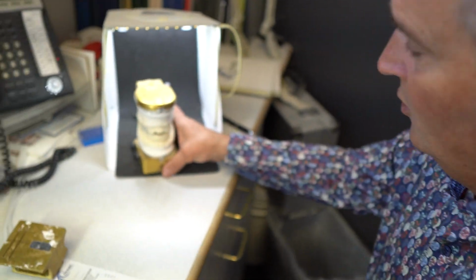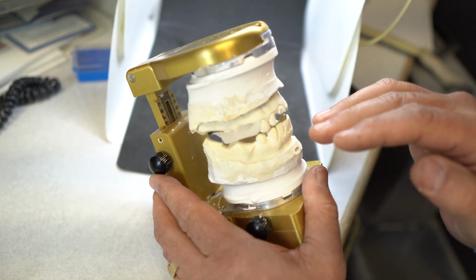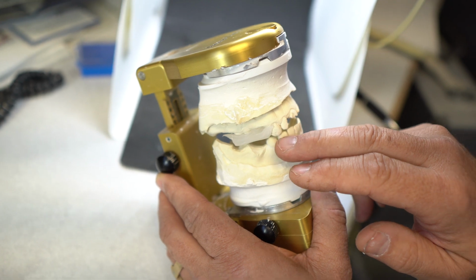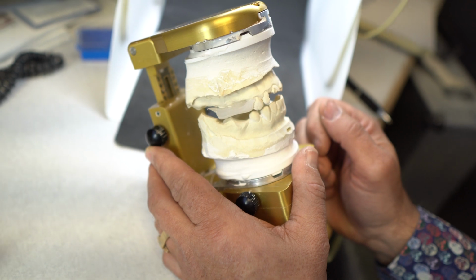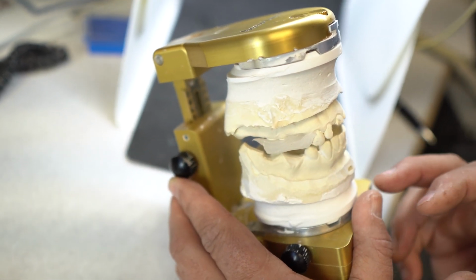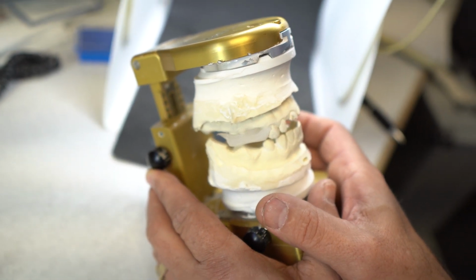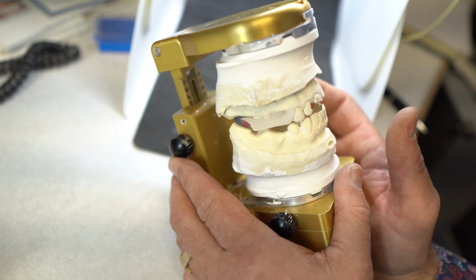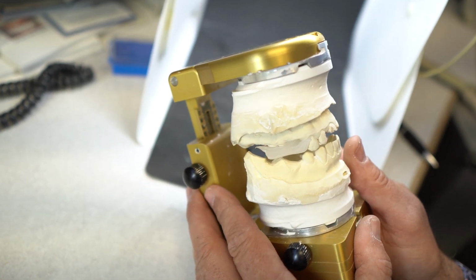The next thing that I'm going to propose to the doctor here is we're going to do an immediate denture, keying off of these teeth and or the F point that complements the length of these teeth, and build it to a nice level plane of occlusion. Then give the patient a hard pivot orthotic for the lower to chew and function on and reestablish this new optimal vertical dimension.